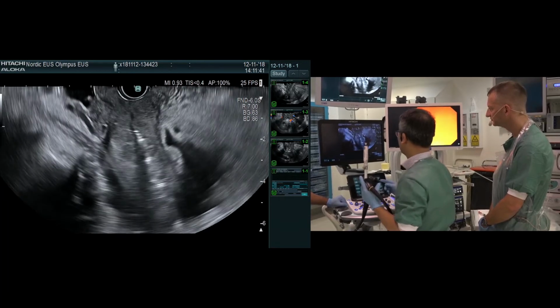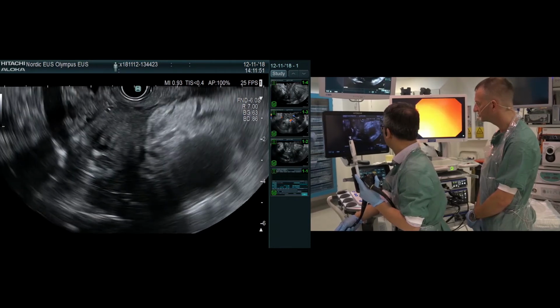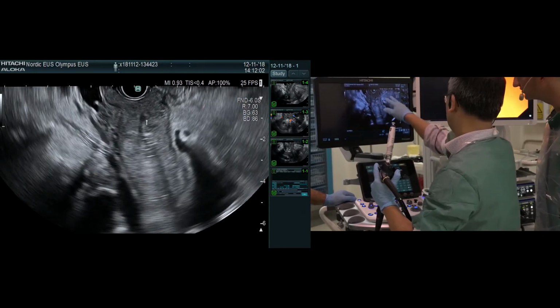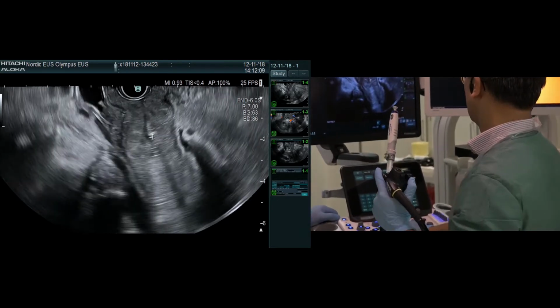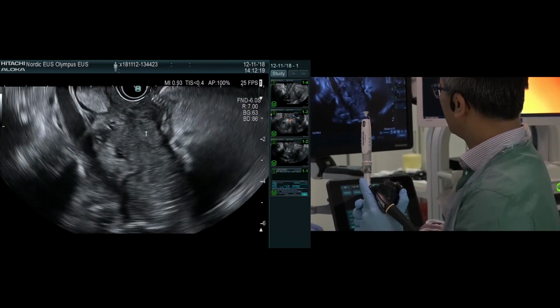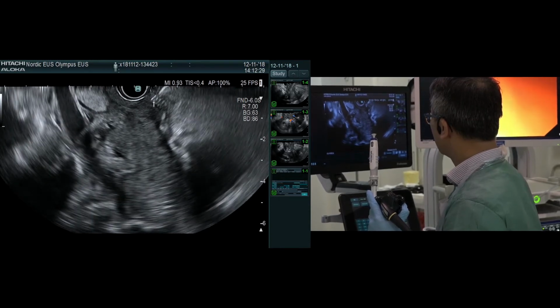It looks like it is a tumor, but I think it could also be a very thickened duodenal wall. So perhaps this is the tumor, and that is the more... I think probably this area here, because if you look at this area, I think maybe we did the first biopsy. Yeah, I think it's from here. Yes, because it looks like air in this area, so this is like the lumen of the duodenum. While if I turn a bit, yes, then you see this lesion here. Okay, then the scope position is not that bad. So I take out the sheath, and already here you can see the opening of the sheath and the layers.